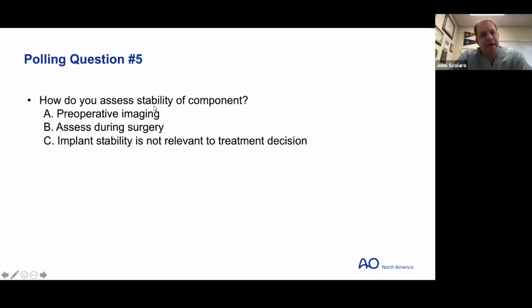No, because the bottom line is, unless it's truly grossly falling out, if you can get this patient to solidify the metaphyseal region, a revision stemmed knee at some point later is much better than a distal femoral replacement or something similar. If you get their metaphyseal area to heal and they have pain from a loose component, that's at least, from what my arthroplasty colleagues have told me, better. We use the same approach in the hip. If you can get the bone around the fracture to at least heal, then a revision is much easier than going to some sort of mega prosthesis.